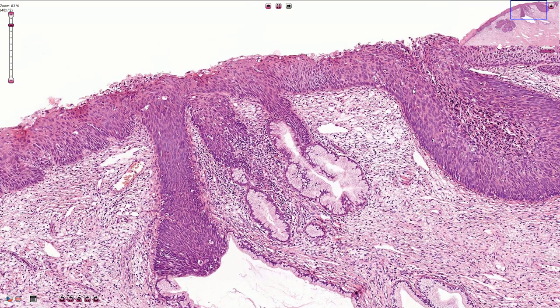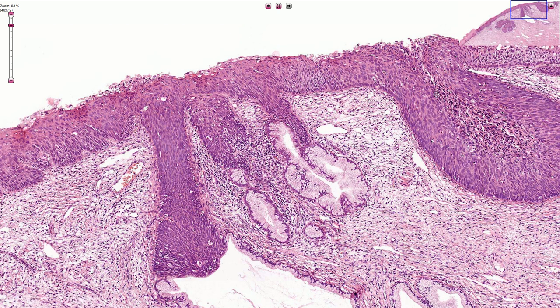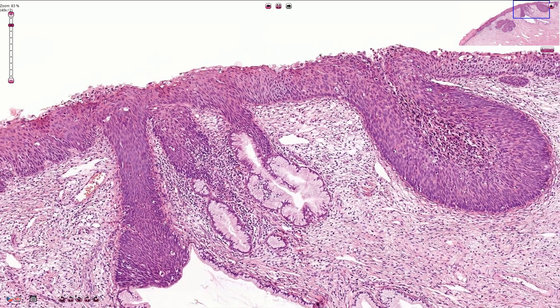According to the last WHO classification, the preferred nomenclature is low-grade squamous intraepithelial lesion or L-SIL, and high-grade squamous intraepithelial lesion or H-SIL. This is an example of H-SIL.